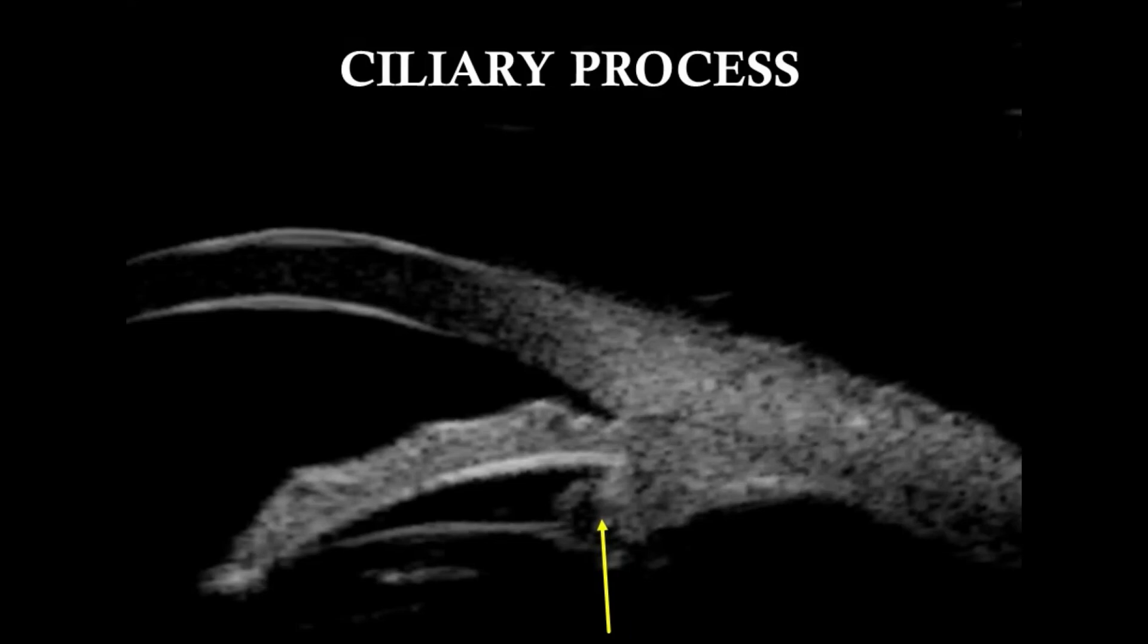The UBM images show the variability of the ciliary process configuration depending on whether the scan is passing through a process or a valley between the ciliary processes.